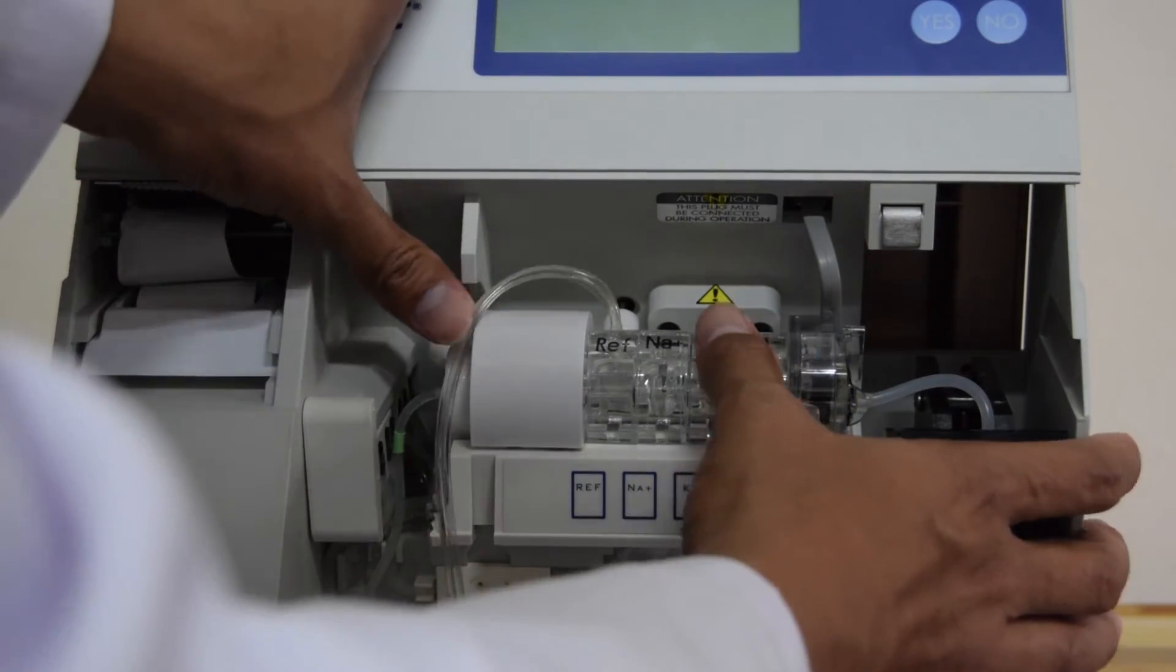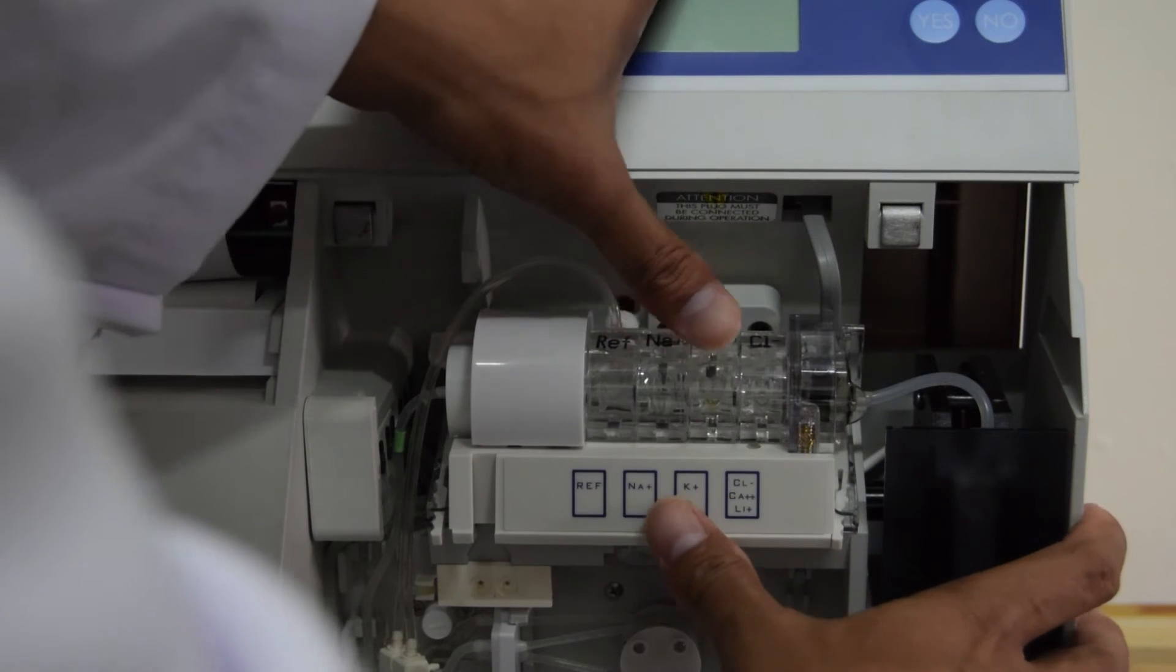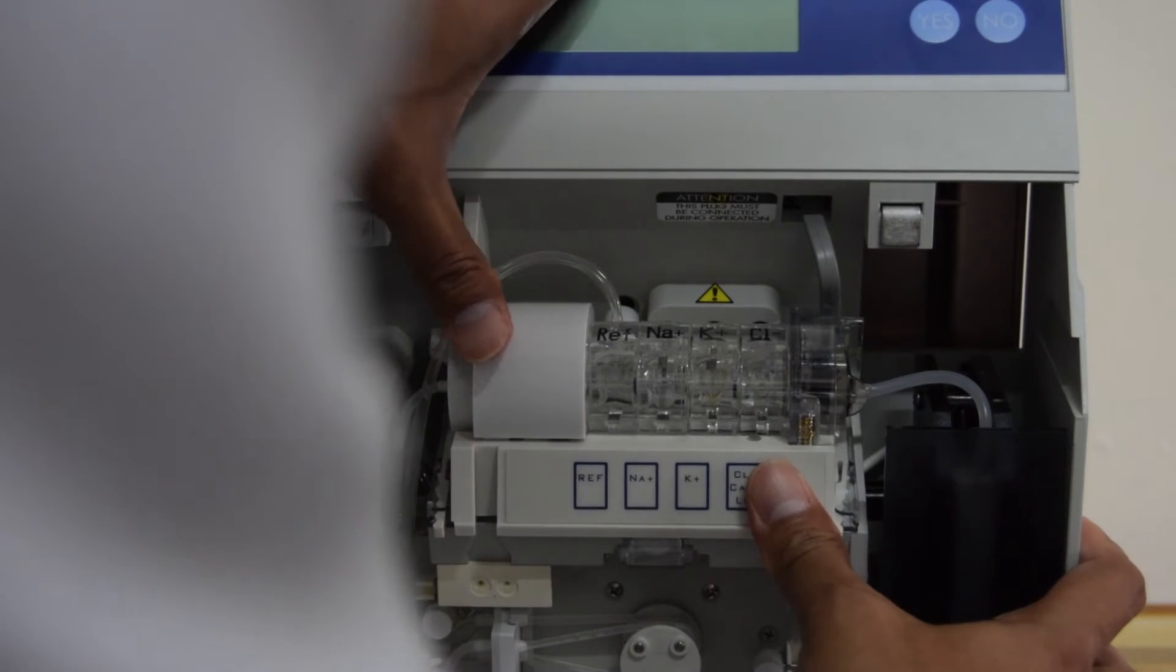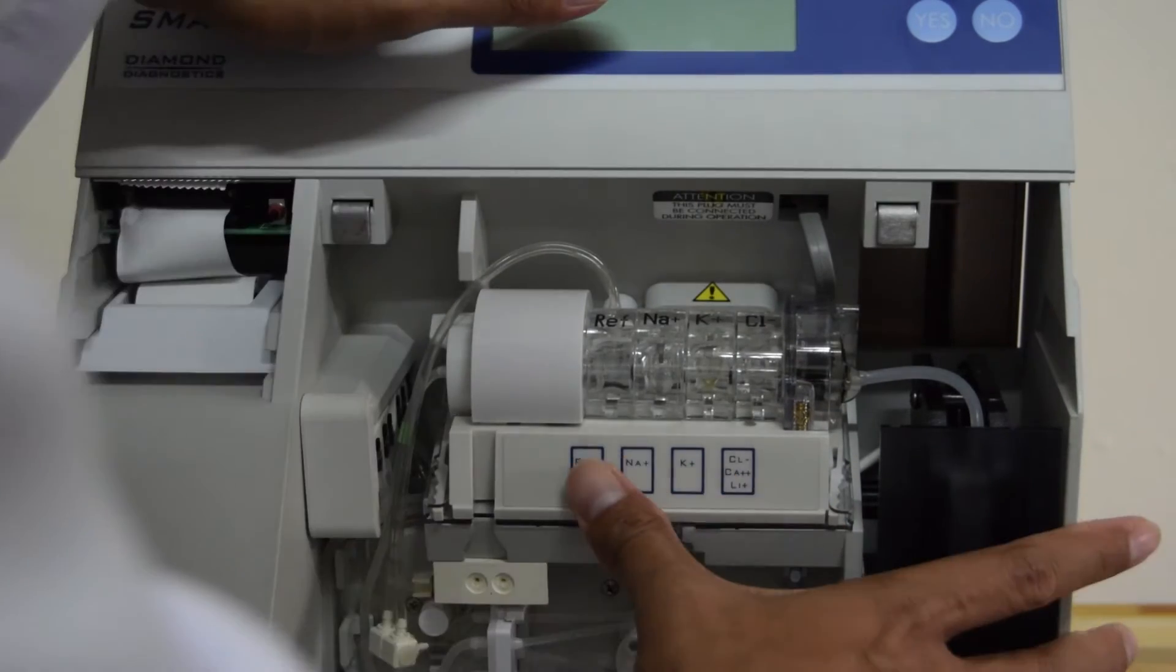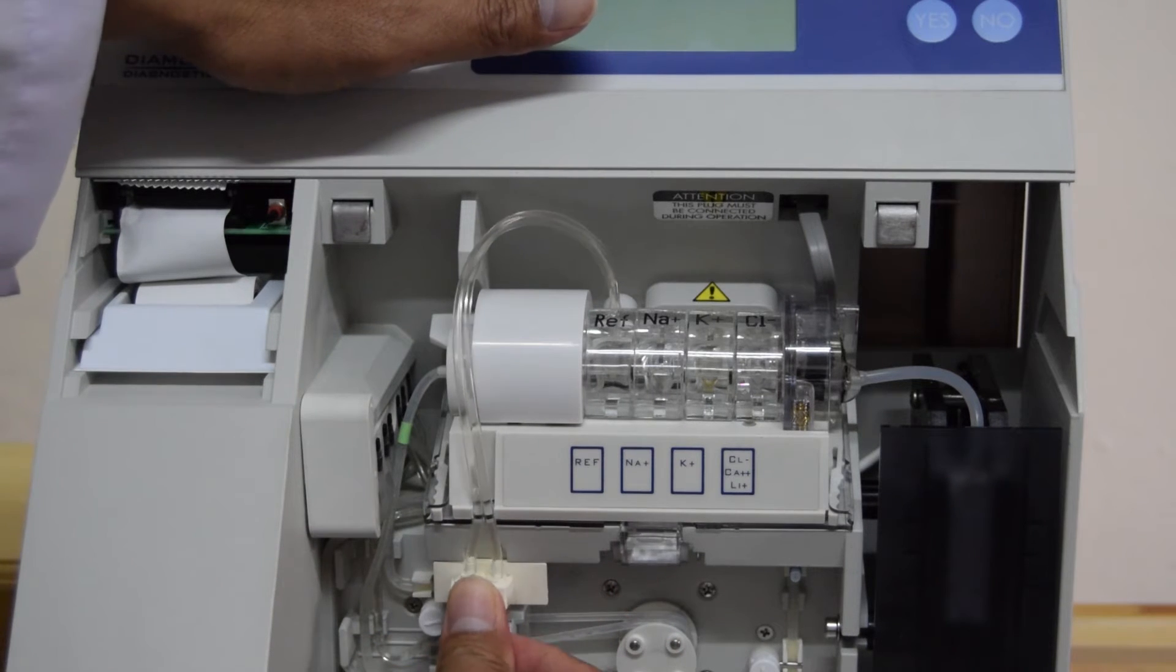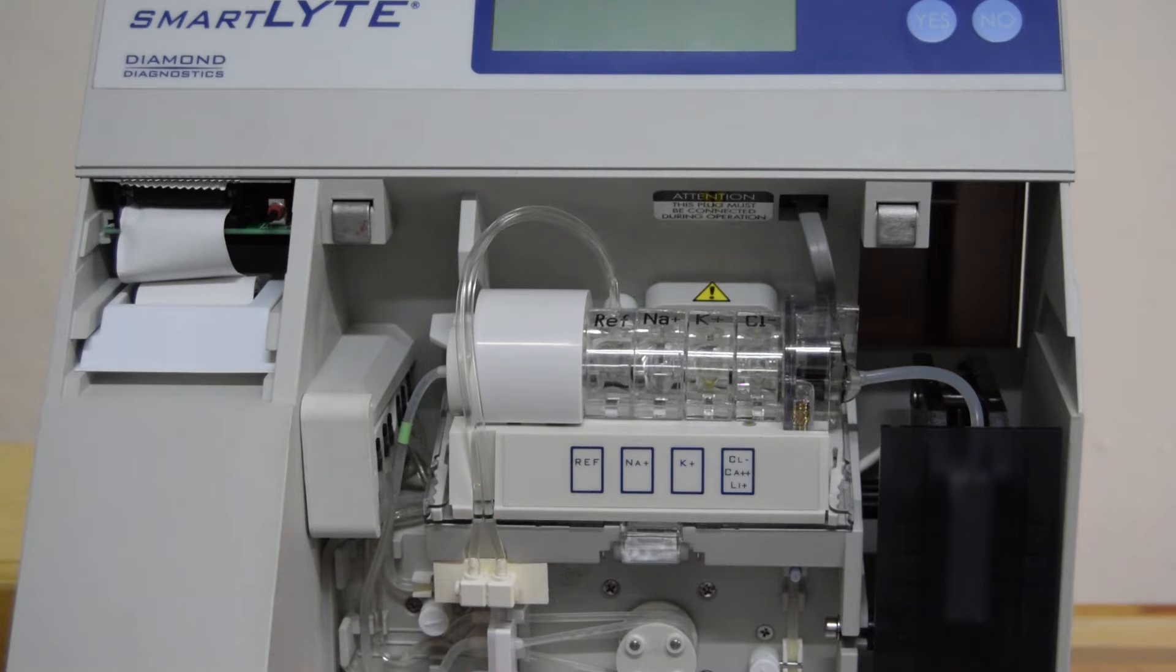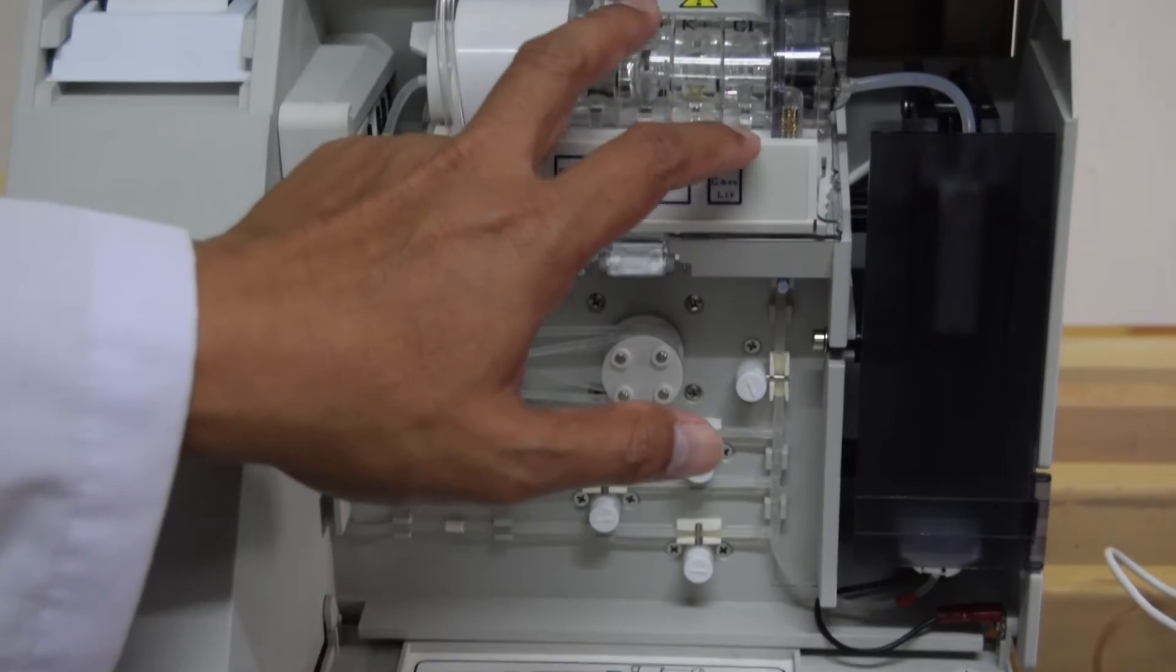Setelah masuk, posisi sudah masuk. Kita tinggal mendorong pelan-pelan. Perhatikan lagi. Dipastikan masuk ke lubang. Setelah masuk keempat-empatnya. Konektor dari ref ditancapkan ke soket ini. Seperti ini. Dan selesai untuk pemasangan elektroda. Jadi kita sudah menyelesaikan tiga step. Tadi melepas penjepitan dari pinch valve, memasang selang peristaltik, sekarang elektroda.